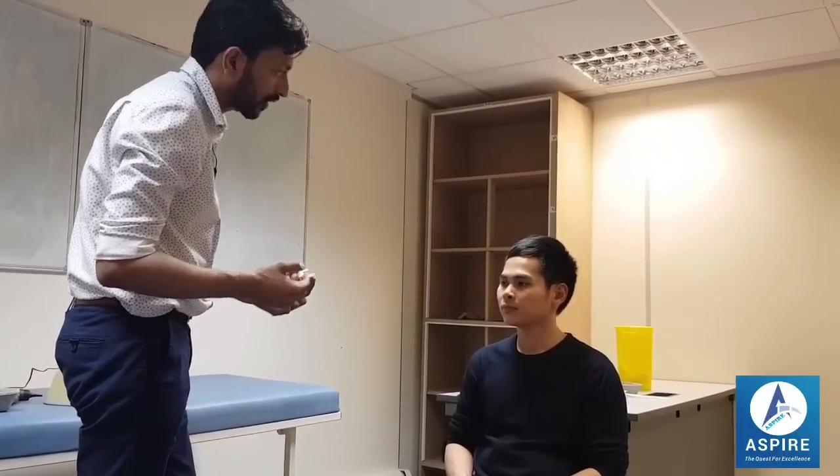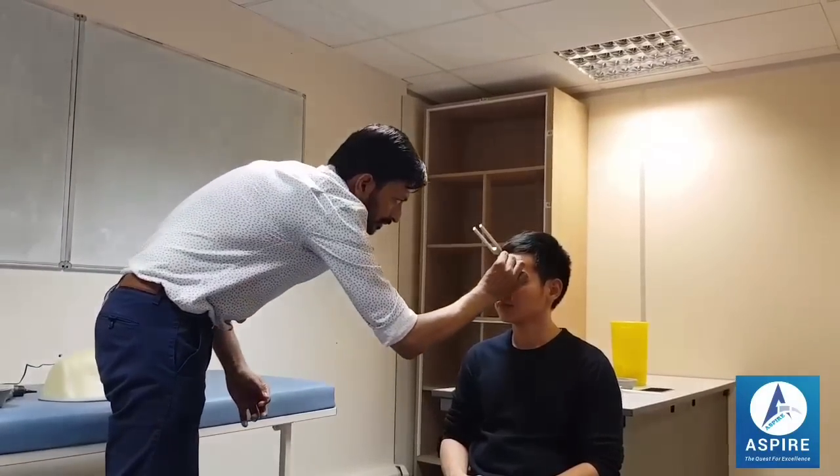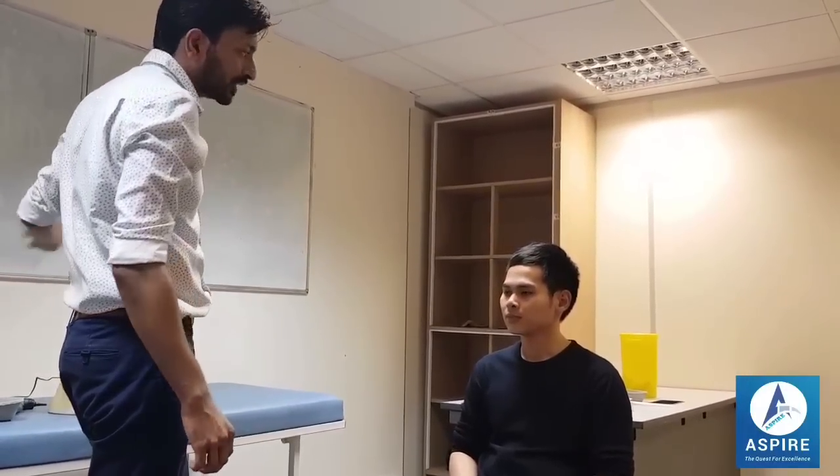Now I'll buzz it again and place it on your forehead. You have to tell me where you can hear better — in the left ear, right ear, or not at all. The Rinne test is positive in both ears, and the Weber test lateralizes to the right ear. My patient therefore has left-sided sensorineural hearing loss.